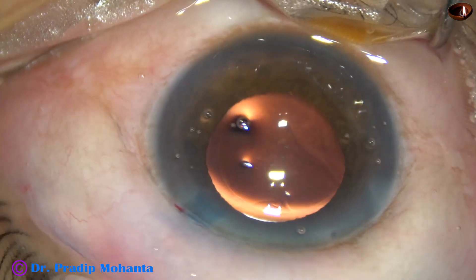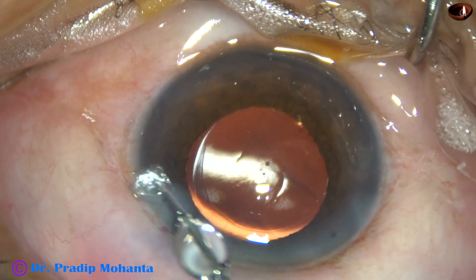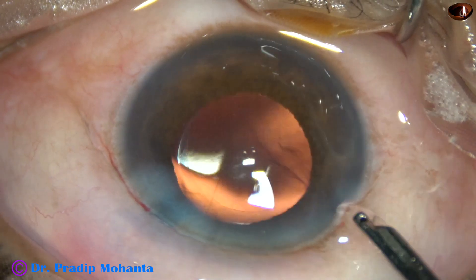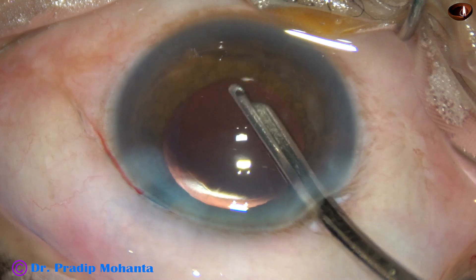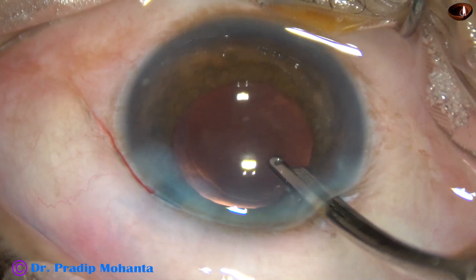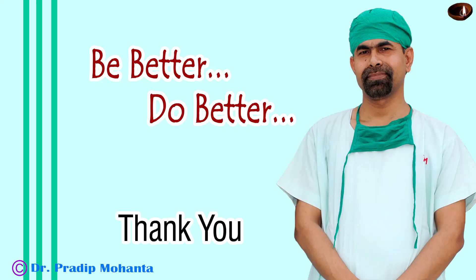Once this is done, with the help of the Simcoe cannula, after hydrating the side port, the viscoelastic that sticks to the corneal endothelium is removed. A gentle stream of fluid is directed towards the endothelium — a lot of visco comes out. The anterior chamber is nicely formed and the case is concluded.